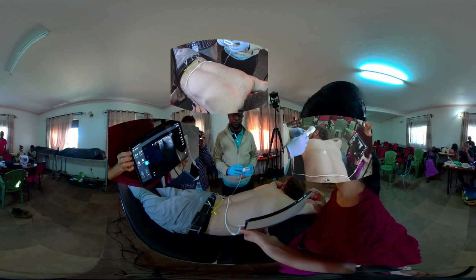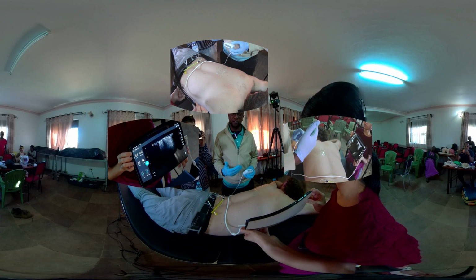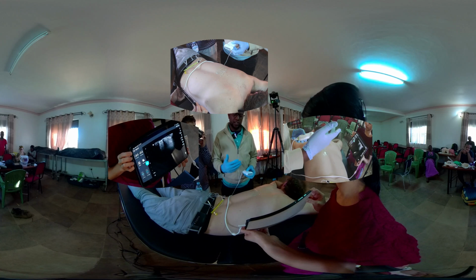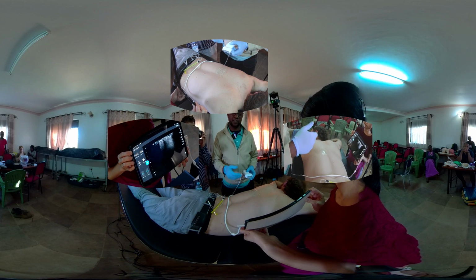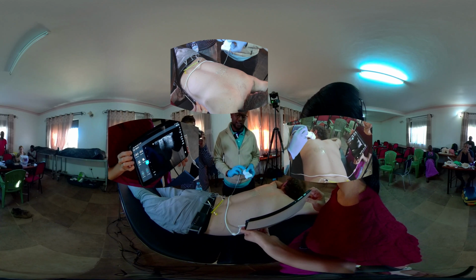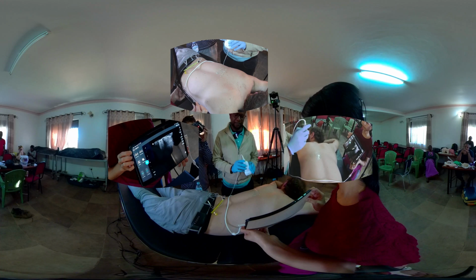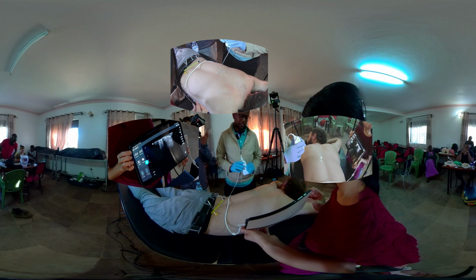So for that you usually get away with a linear probe. That would depend on the habitus of the patient. With a linear probe, that will work for most lean patients. For heavier patients, you may need a curvilinear probe. The depth will depend on whether or not we can see the ribs as we scan.